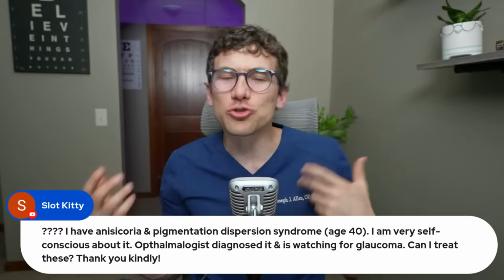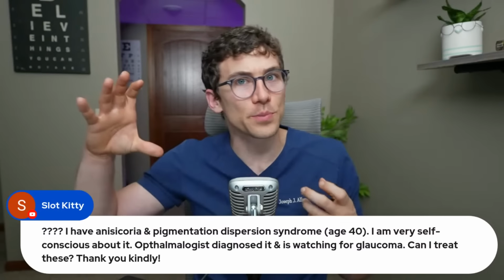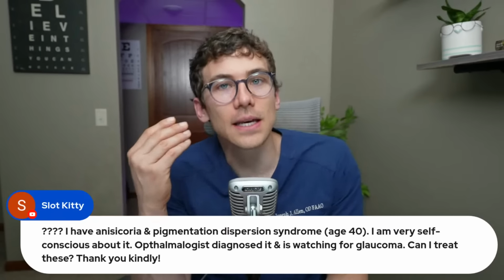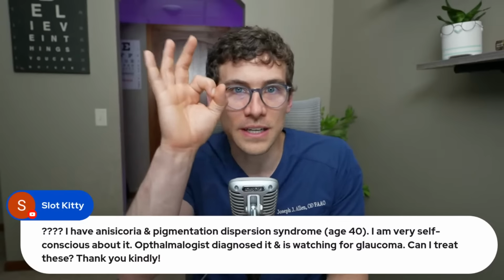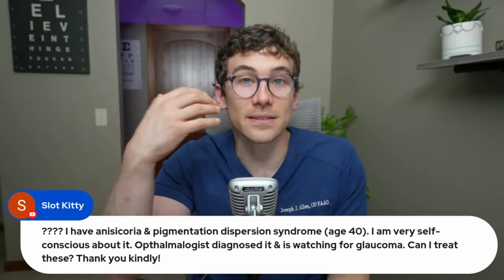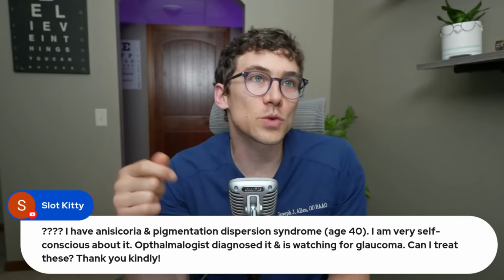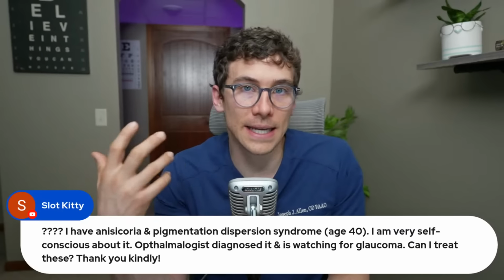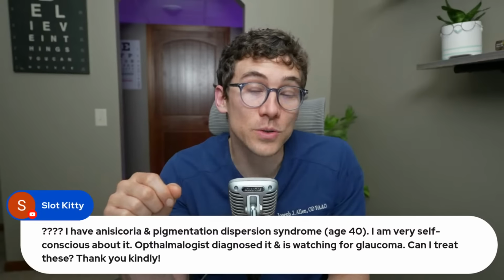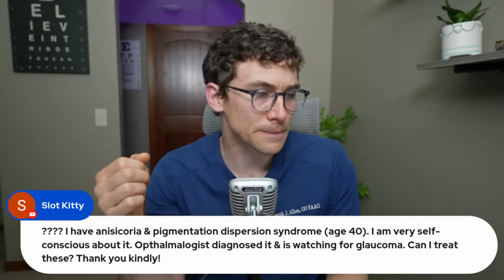Typically, you can't really treat or do much for these conditions. If somebody's really bothered by anisocoria, like their pupil is really large and they're having glare and light sensitivity issues, there are specialty contact lenses that can be made to give you the appearance cosmetically, but also functionally, they can give you the same optical benefits of having a normal sized pupil. And for individuals who've lost their iris from something traumatic like damage, there are iris implants. I even have a patient who's had a custom iris implant implanted in the last year. It's pretty amazing what they're doing.